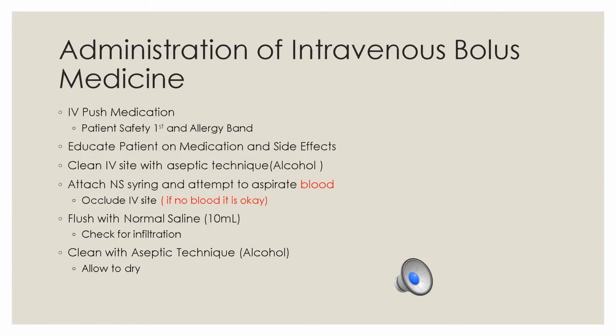After you push your medication, clean with an antiseptic swab such as alcohol, and then you're going to flush again with 10 mL of normal saline. As you're pushing this medicine and after you give any medicine IV bolus, you want to assess for therapeutic side effects.